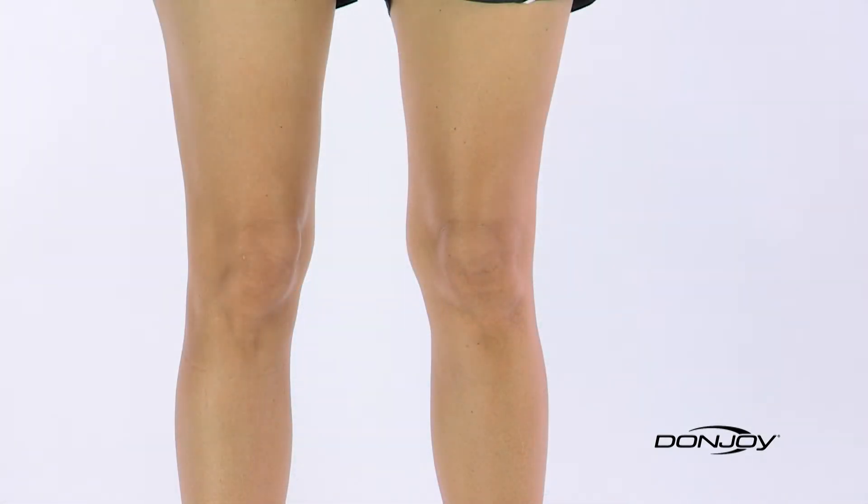To determine your DonJoy knee brace size, you'll need a tape measure to take three measurements: one at knee center, and then at your thigh and calf, six inches above and below your kneecap. The best way to do this is to stand with your legs shoulder-width apart, legs slightly bent, with your muscles contracted.